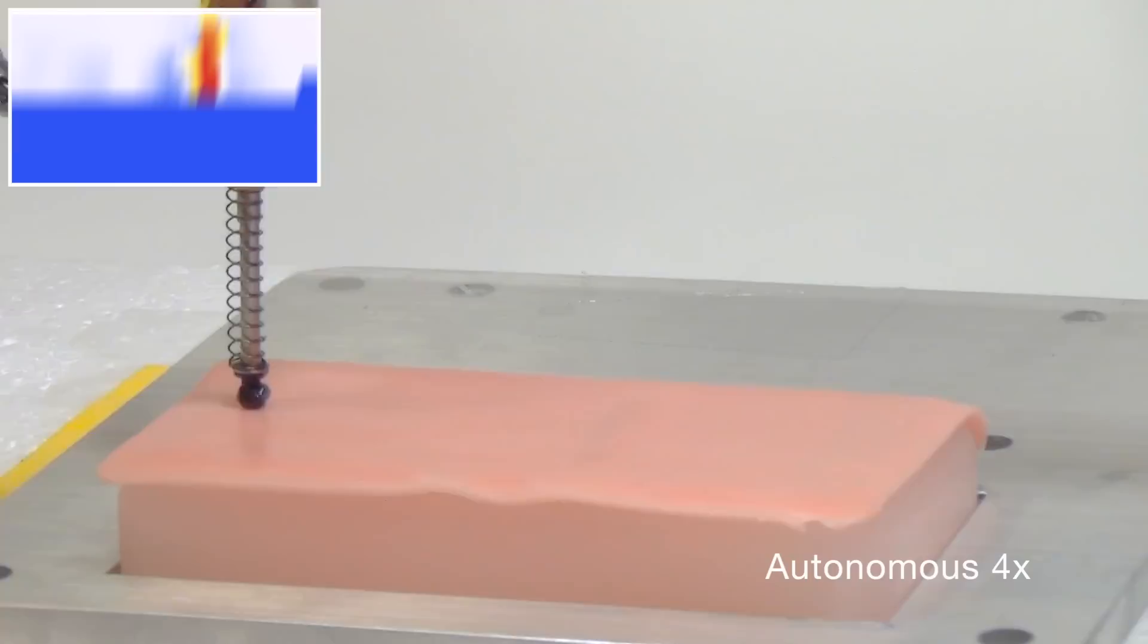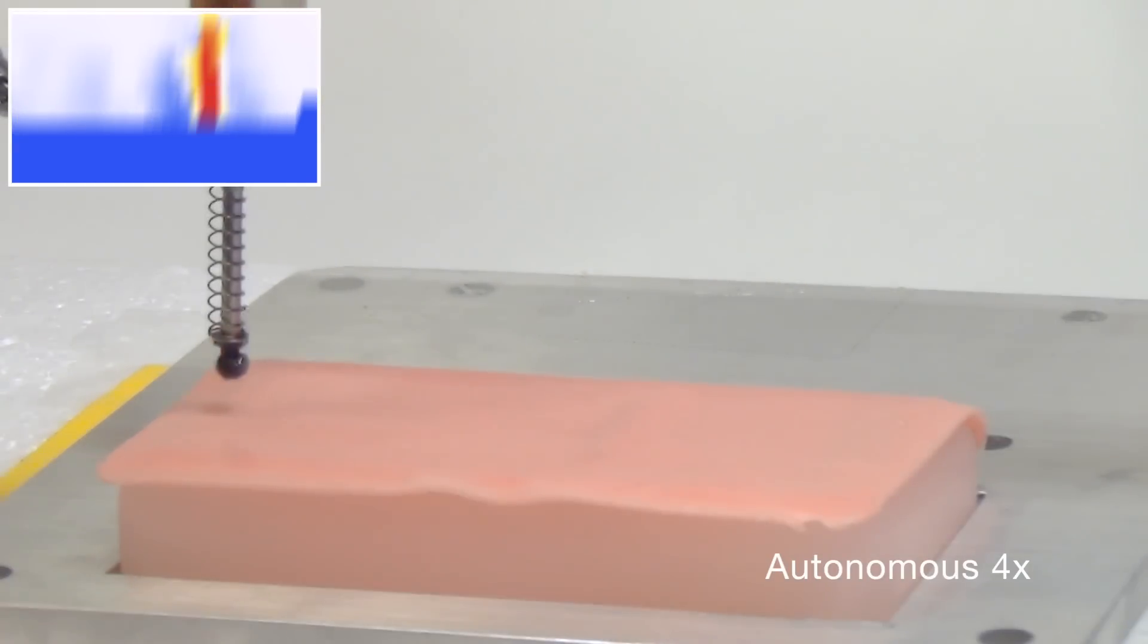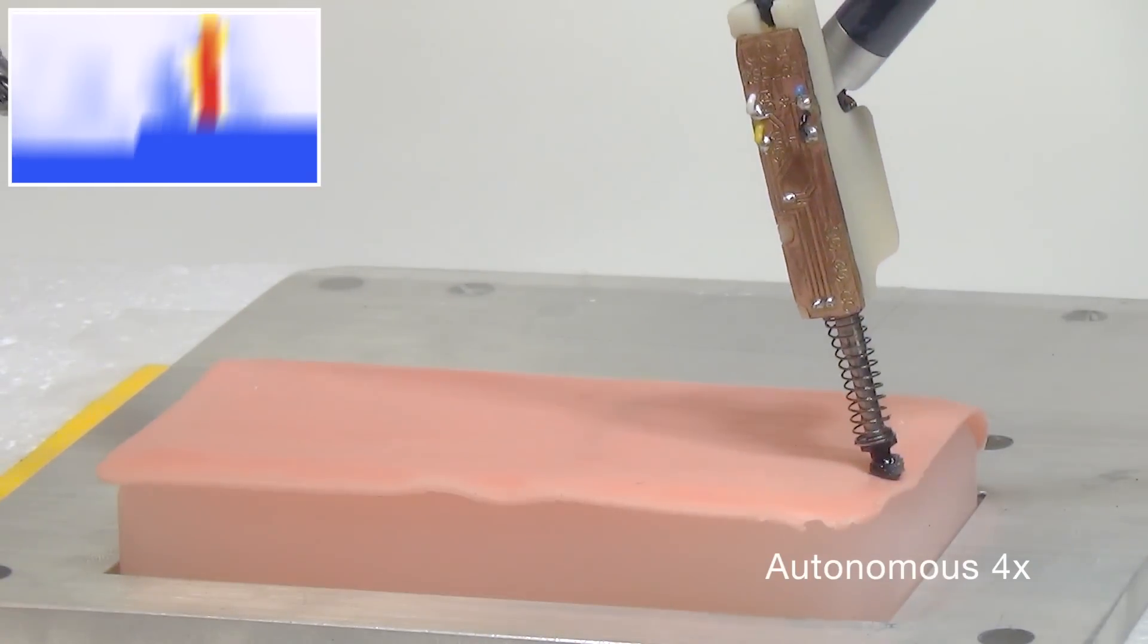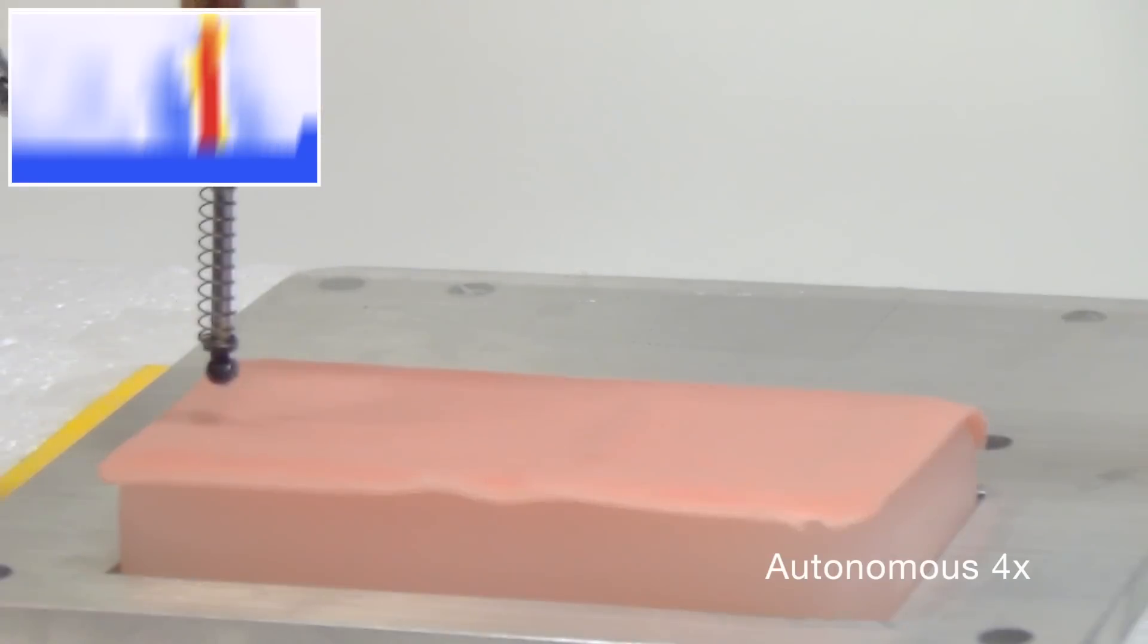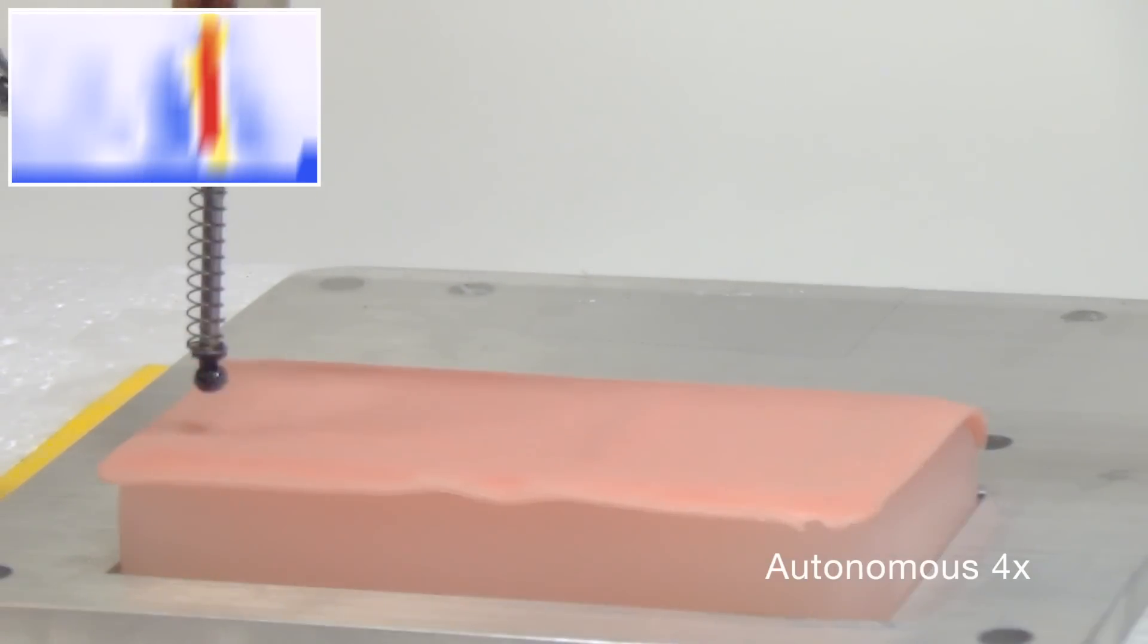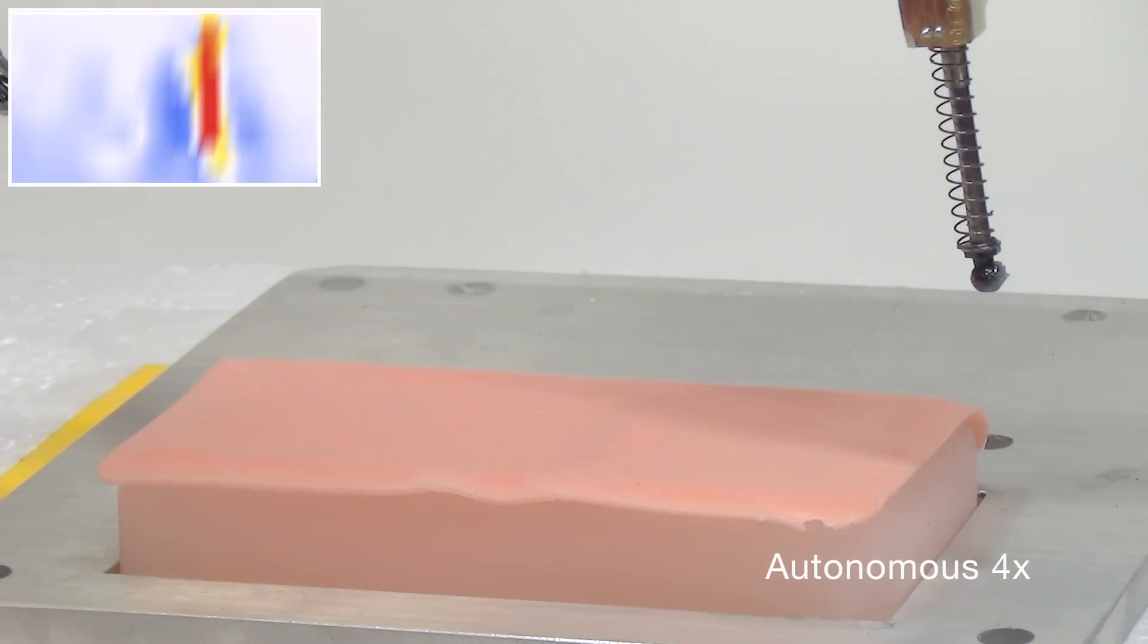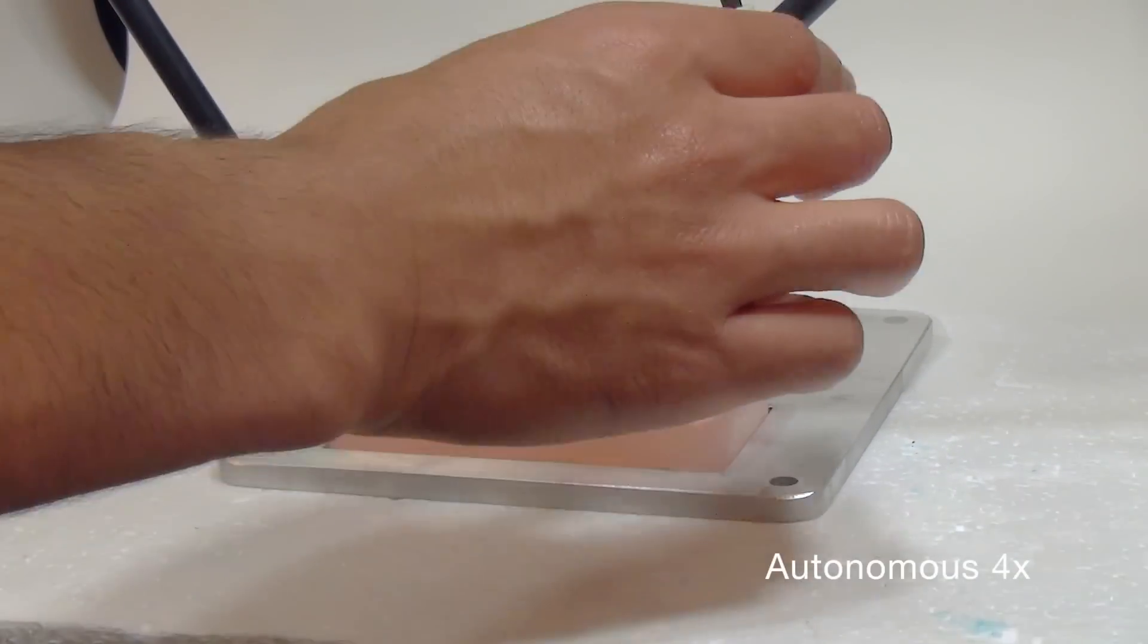The first step is tumor localization. We designed and implemented a low-cost, single-use palpation probe that fits on the end of a standard DaVinci Classic tool. It uses a Hall effect sensing mechanism to localize subcutaneous tumors based on end-effector displacement. Here we see the probe scanning the surface with eight parallel passes to estimate the tumor location.